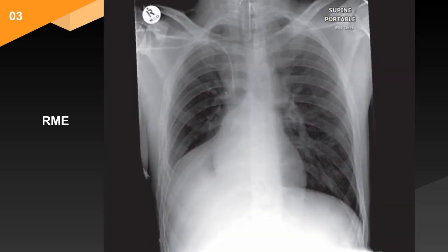This is a supine radiograph of an adult patient. There is an ETT tube in an apparently satisfactory position and a right-sided central venous catheter, presumably a subclavian line, which also appears appropriately sited with the tip projected over the lower SVC. The patient is also wearing a collar for immobilization of the cervical spine.